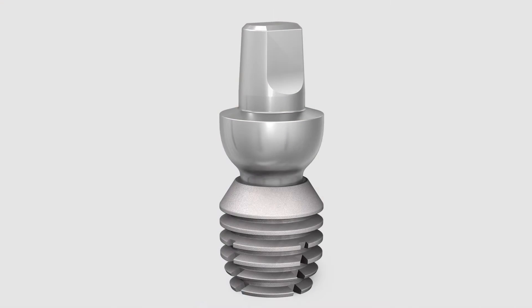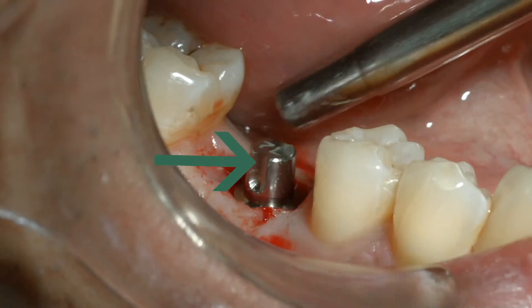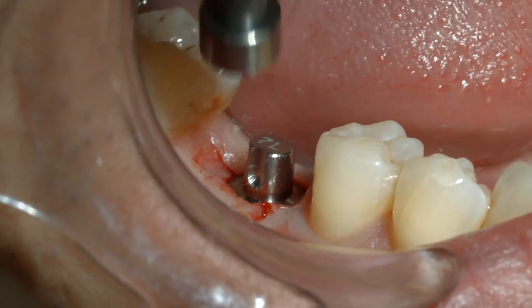For the Baikon system, this is very simple to be done. If you're inserting an abutment only, all the Baikon abutments for fixed restorations have a flat side that we can line up towards the buckle, so it's easy to know the proper direction of that abutment.